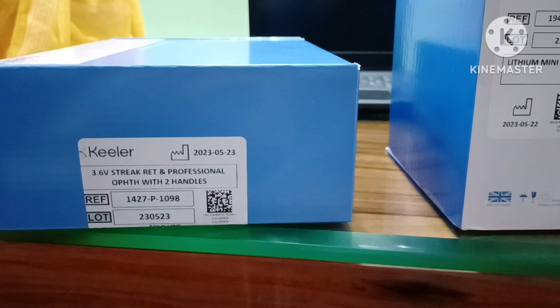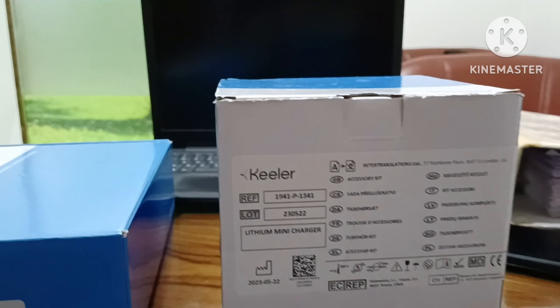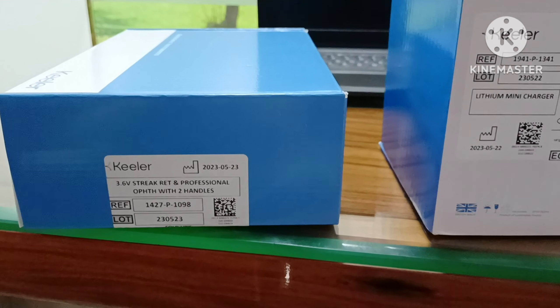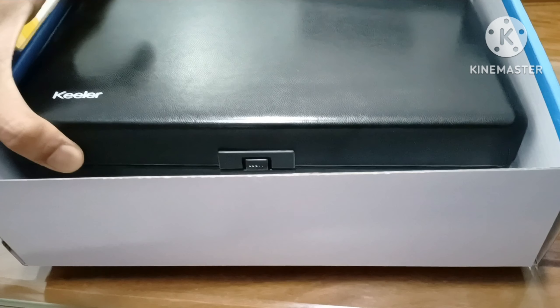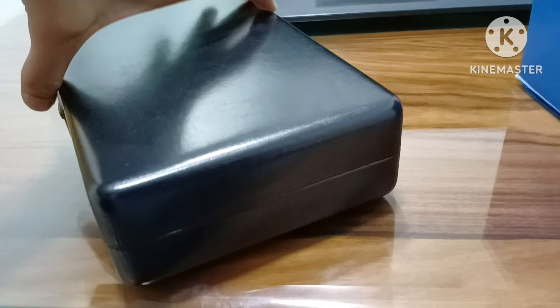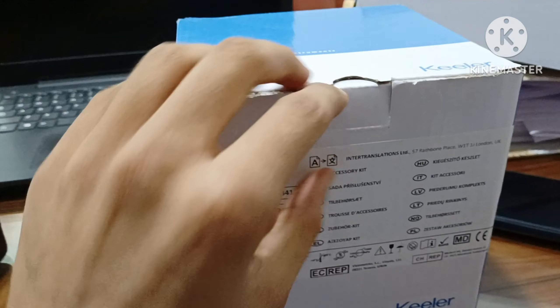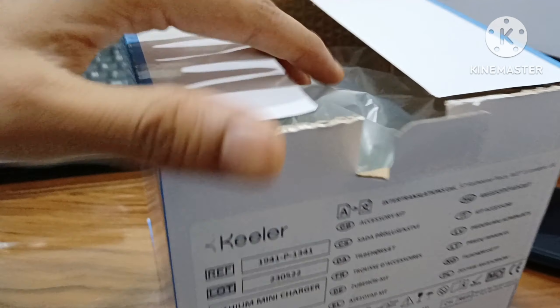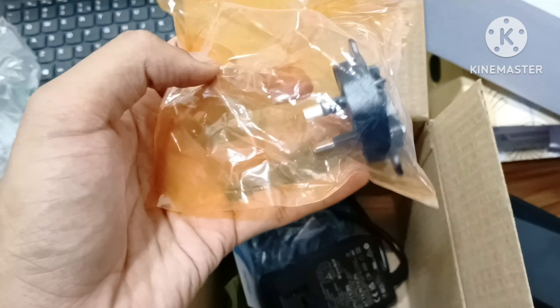Keeler Combo Set 3.6W with charger, with all adapters type.